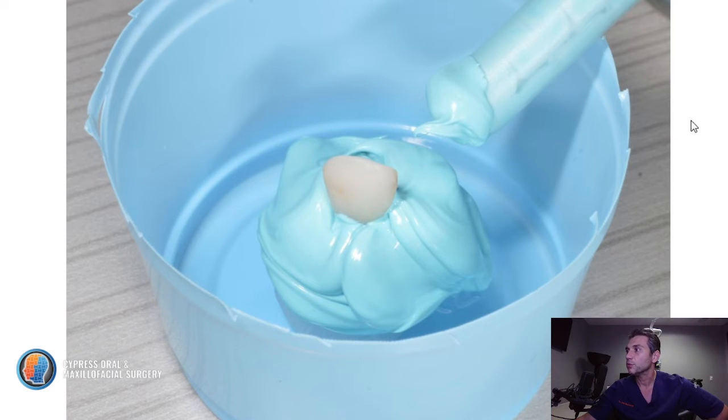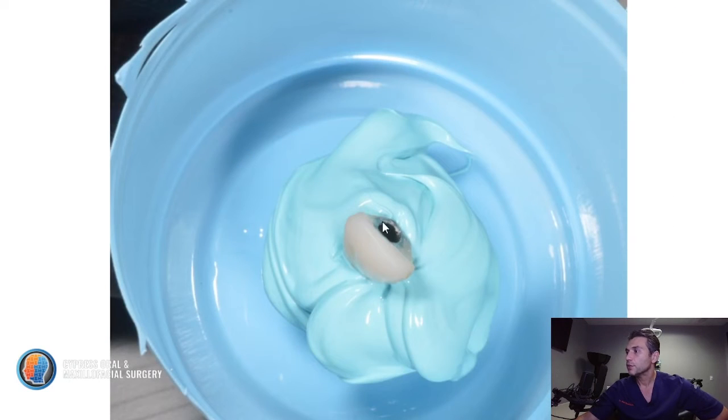Here I used Blue Moose just because it's quick. It sets in about 30 seconds. But sometimes with the Blue Moose, what I notice is you get bubbles in there and it's just not very accurate. Here's a view from the top.